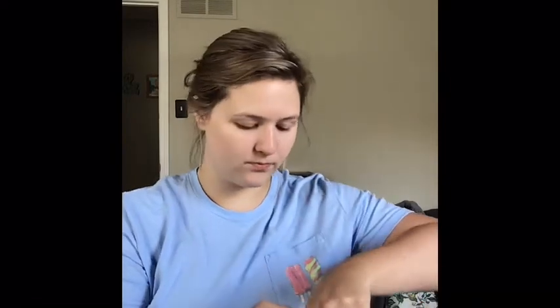So next I am going to measure. I'm going to go ahead and take my NG tube out of the package. And I would have gloves on. I don't have any regular gloves at my house, so we're just going to pretend that I have gloves on. And then what you can do is wrap it up in your hand and get it a little bit warm so it goes in easier.